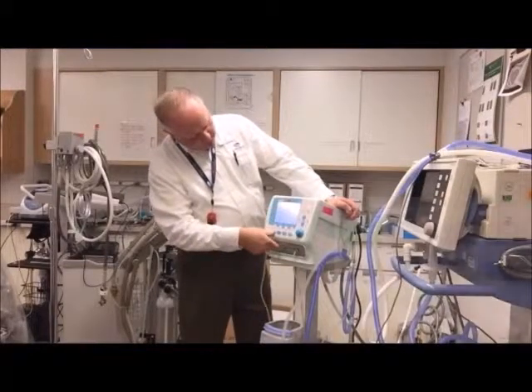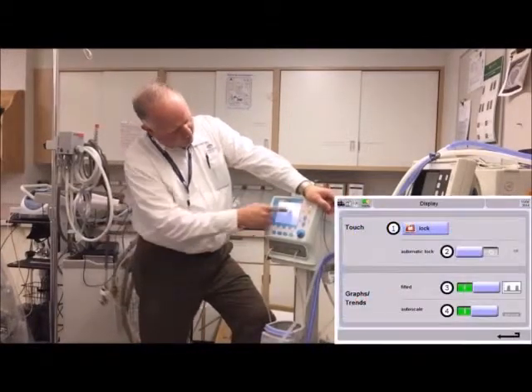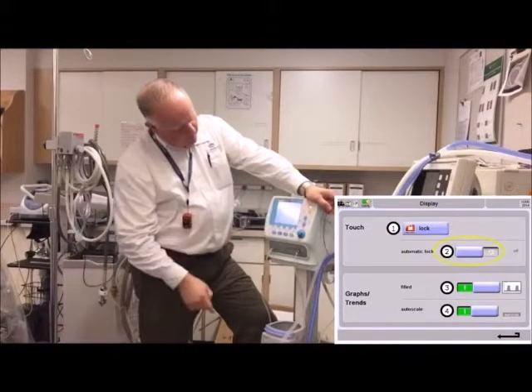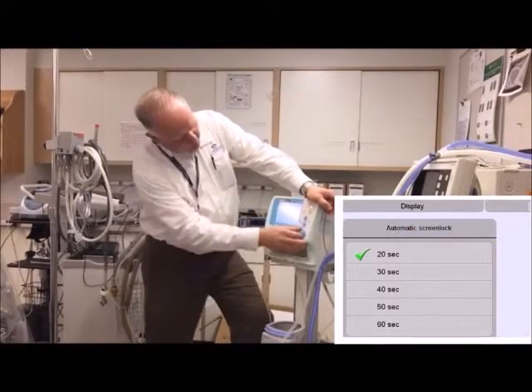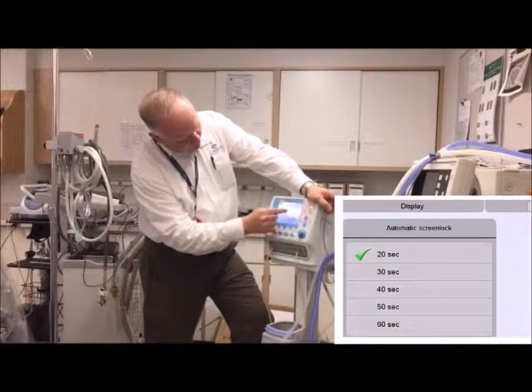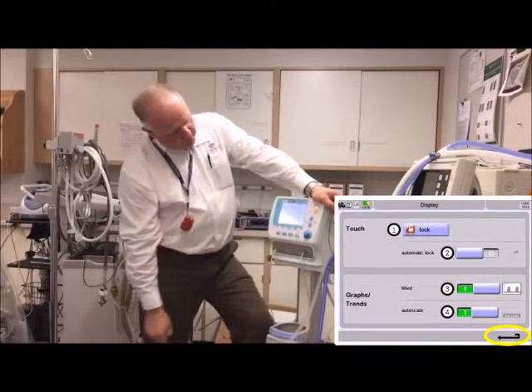Going into the sub-menus: under Display, I can lock the screen. Push any button to unlock it. I can set it to auto-lock — currently after 20 seconds — but I can adjust that to 60 seconds or 30, whatever I want. To get back to the other menu, hit the return button in that gray bar.